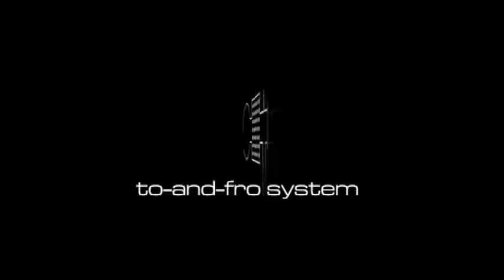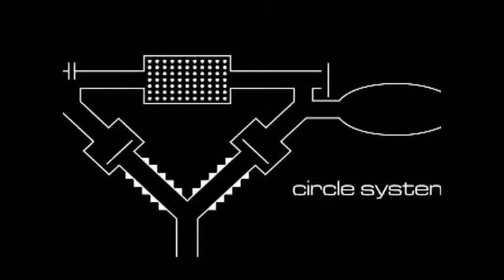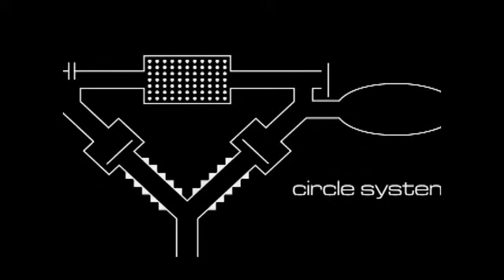The last example in our presentation refers also to the so-called circle system and may be used as a half-open or half-closed system with low or medium respiratory minute volume characteristics. A third option is the use as a closed full rebreathing system, where the fresh gas flow equals the uptake.